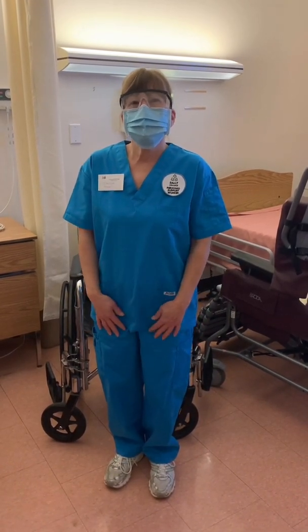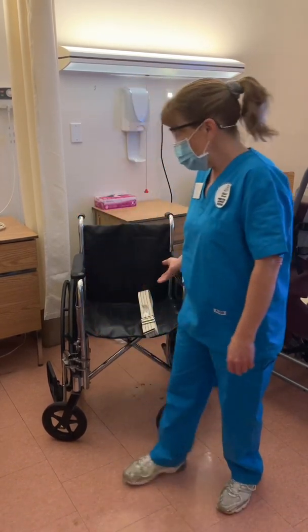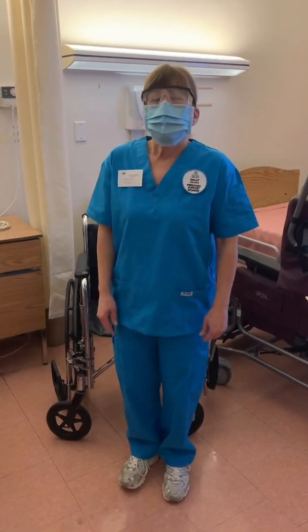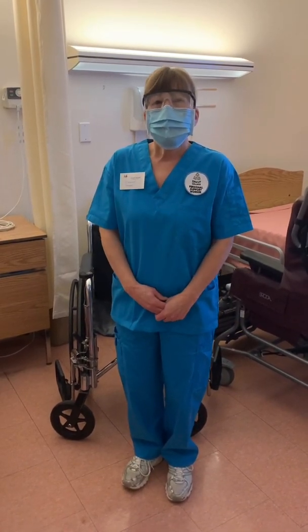This video will demonstrate the skill of transferring a client from bed to wheelchair. Before we begin, there are a few things I would like to note.